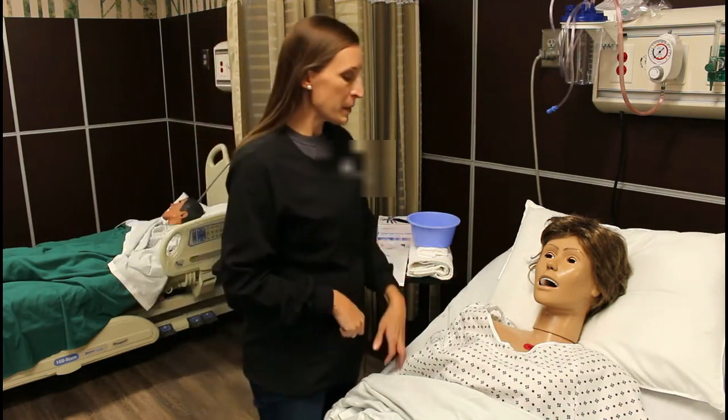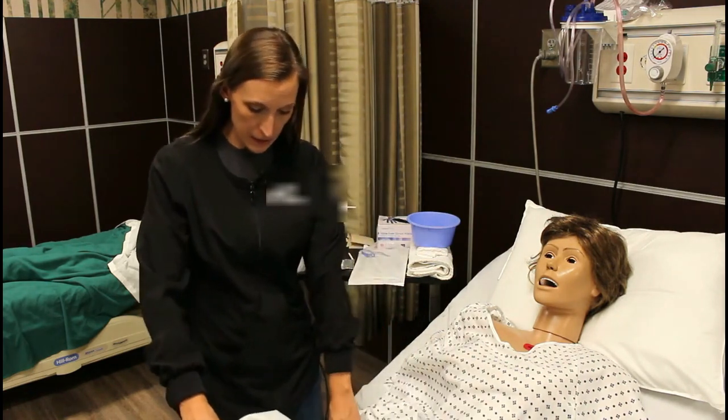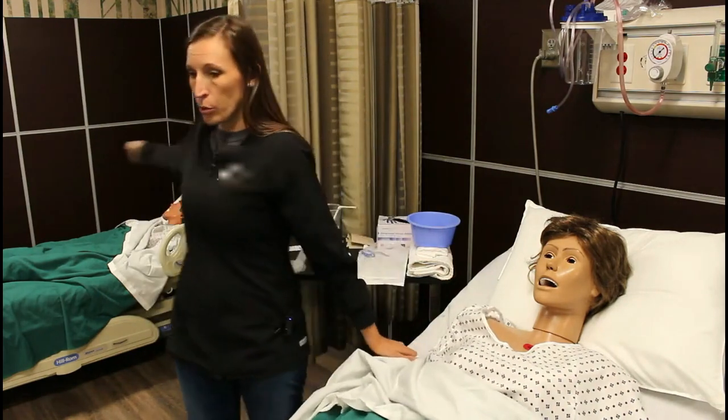Hello, my name is Ms. Conley, I'm going to be your nurse today. I'm going to check your ID — can you tell me your name and your date of birth, please? Okay, thank you. I'm going to provide for privacy and pull the curtain.